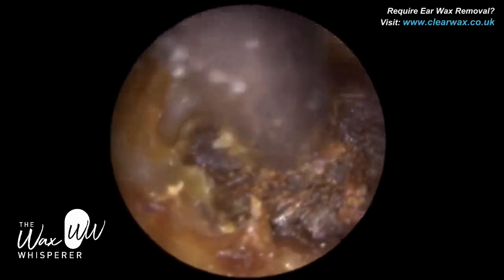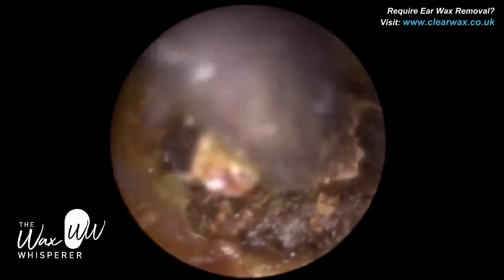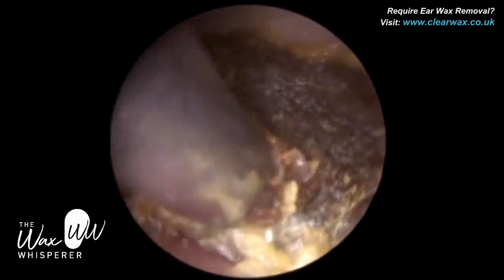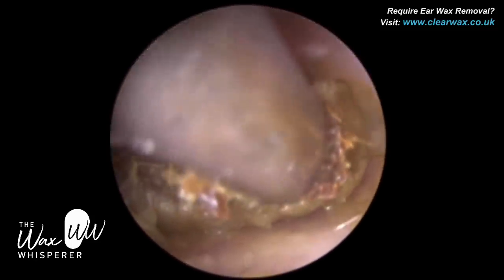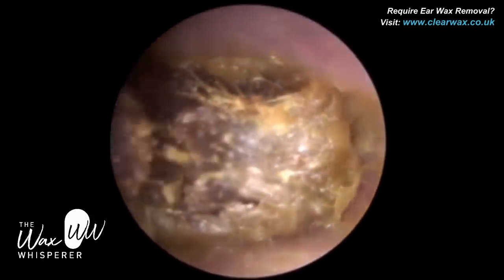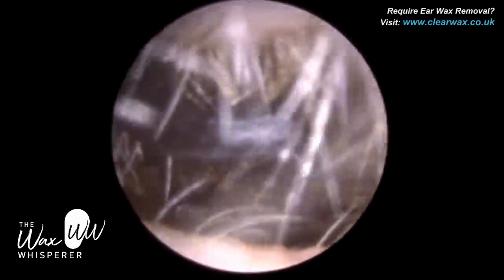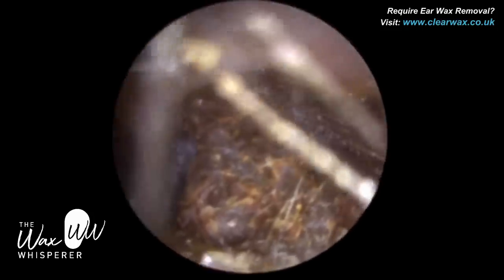When you've got a plug of wax this dense — I called it a hard core earwax removal because you can't visualize it — when I'm on this plug of wax with the suction probe, the dissolver suction probe, I could just feel how hard the core was, how dense this plug was. When the core is this hard, drops are really not going to do much. They might penetrate the outer surface and that might become a bit softer, which did happen — the outer layer was a bit softer when the patient attended.